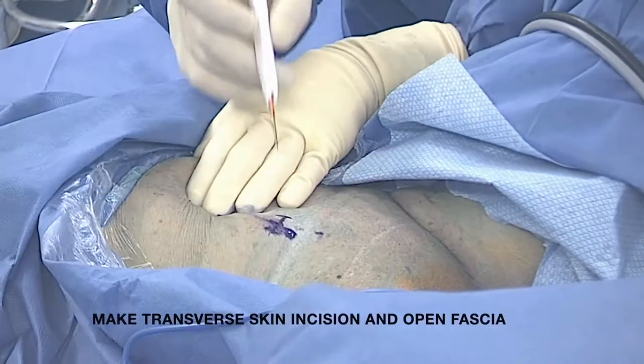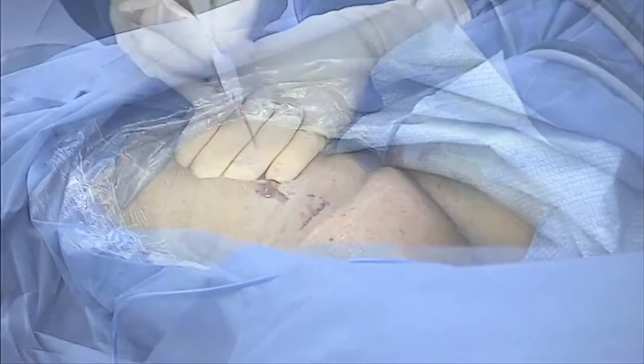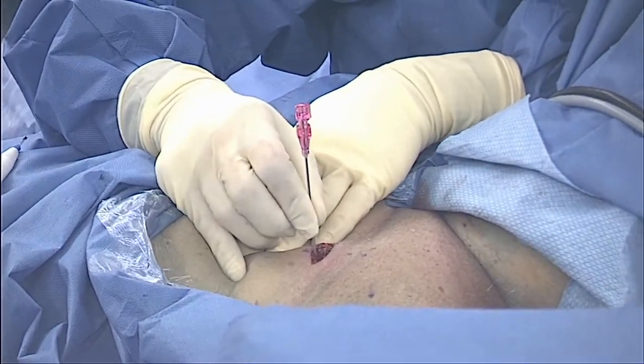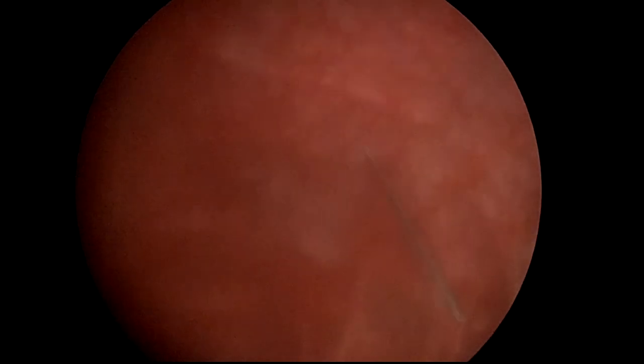We then make the skin incision in a transverse fashion, after which we can palpate for the underlying fascia and make another incision through this layer. We can confirm entry into the bladder by placing a spinal needle through our incision into the bladder, the placement of which can be confirmed with a cystoscope. The cystoscope can also be used during this process to ensure that the bladder is full.